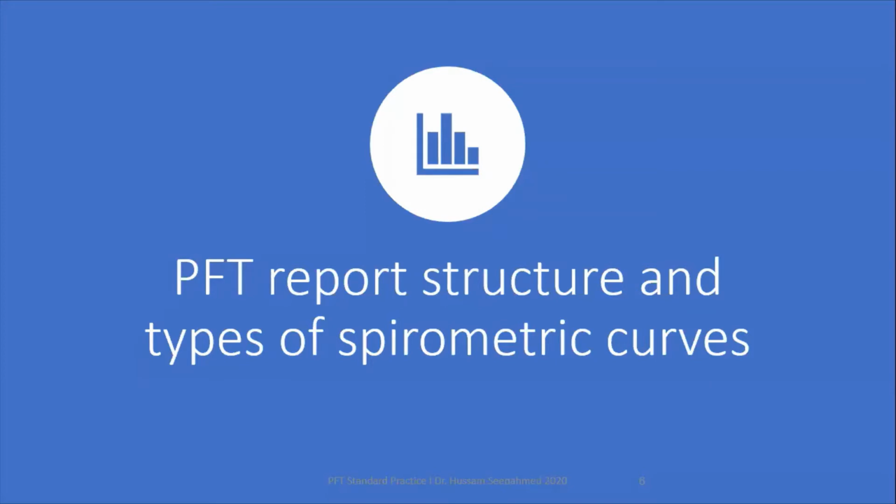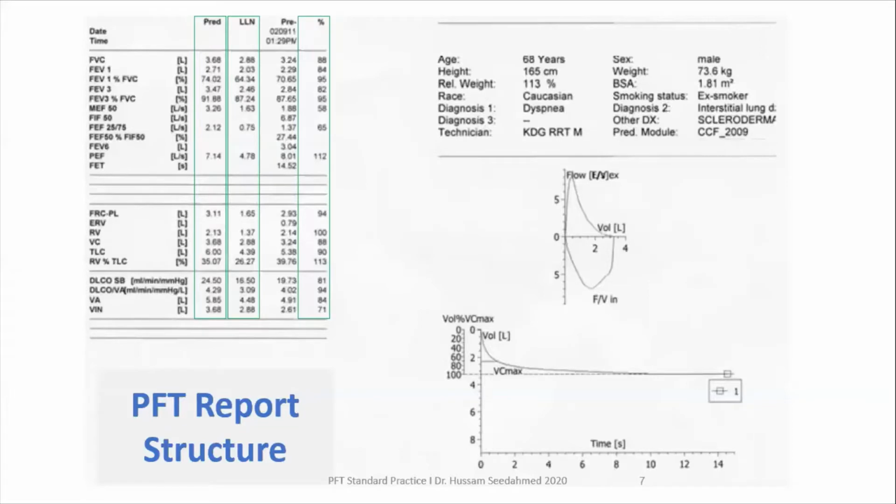So let's start with the first section. That is, we will have a general look at the PFT report and the different types of spirometric curve. Now, this is the standard PFT report.